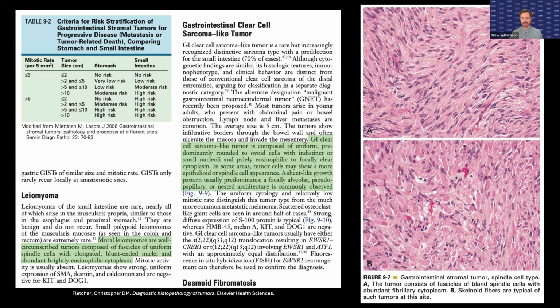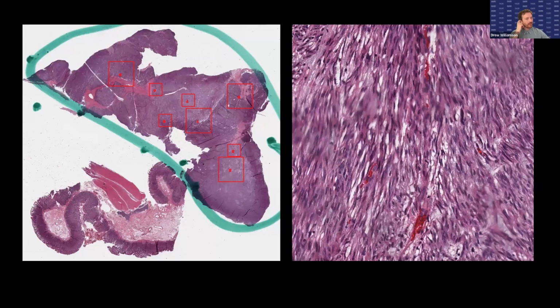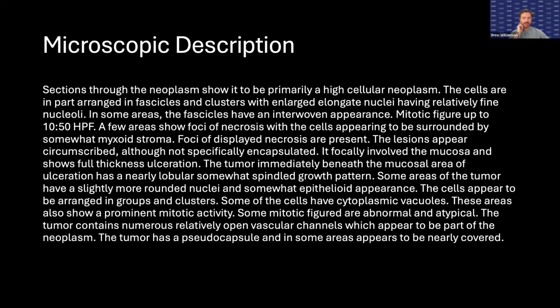And so I think, nowadays, if you have some histology images and you need to understand what's in them, you really want to extract some histologic features. A totally valid thing to do is to give those slides or those histology images to a pathologist, and they might look at low magnification, as on the left. This is another gastrointestinal stromal tumor, or GIST. You might look at high magnification, as on the right, and they could generate for you a microscopic description.